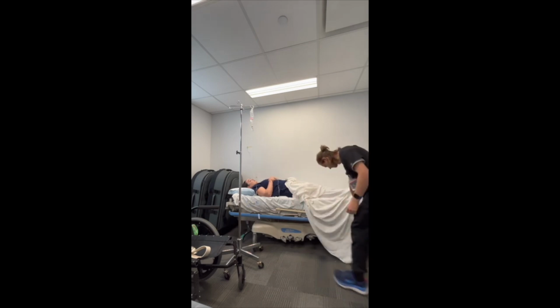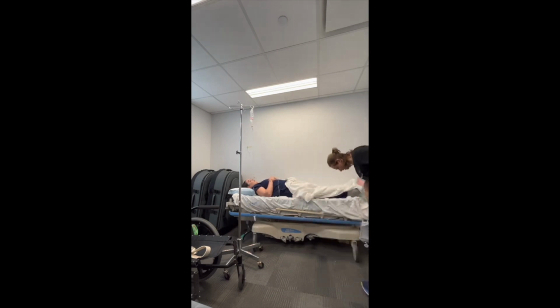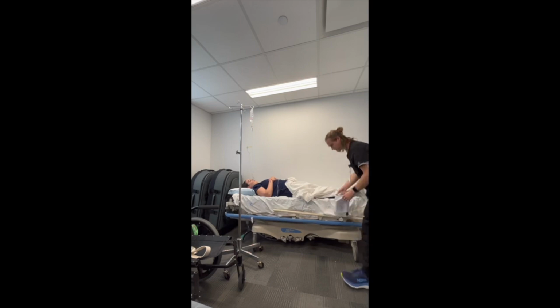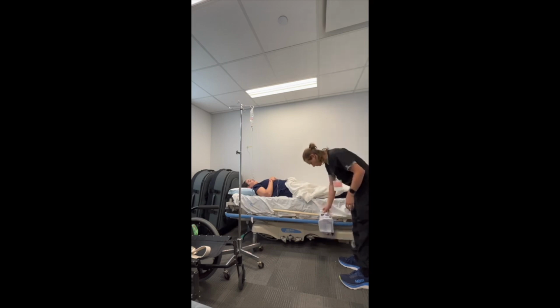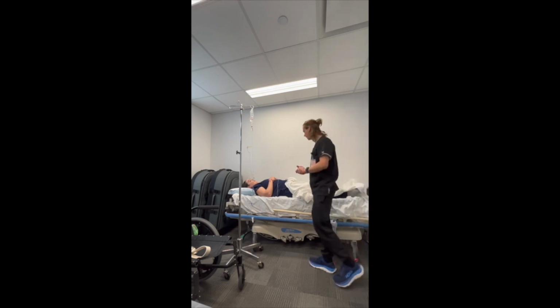And then we also see over here, we've got a Foley catheter running up there, and we want to make sure that we know where each of those is running before we move so that we don't get anything crossed up.